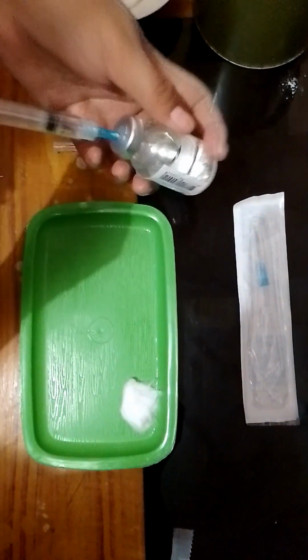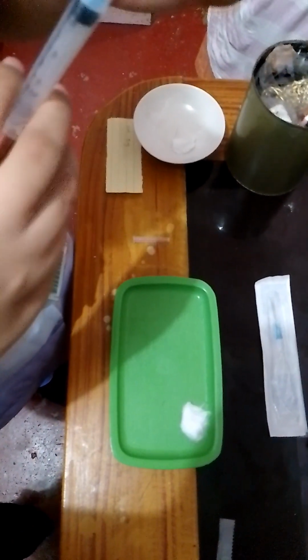And then invert the vial. And then draw the exact medication needed. It would be 1 ml.